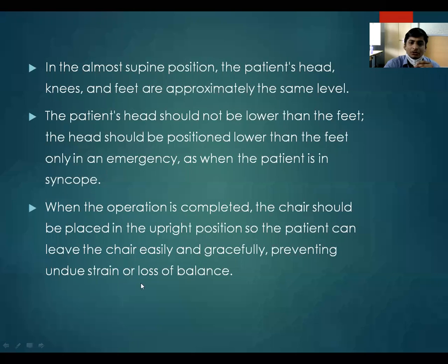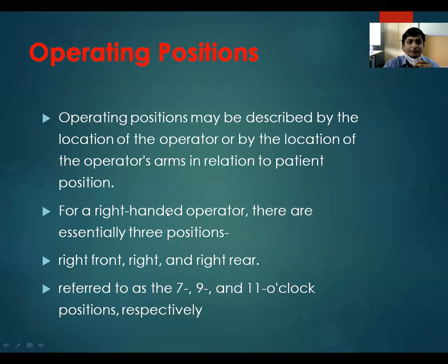Preventing undue strain or loss of balance. So after completing the procedure, the chair should be in the upright position, and then the patient should leave the chair. You are not supposed to ask the patient to get up directly from the supine position. Make the chair upright and then ask the patient to leave the chair.